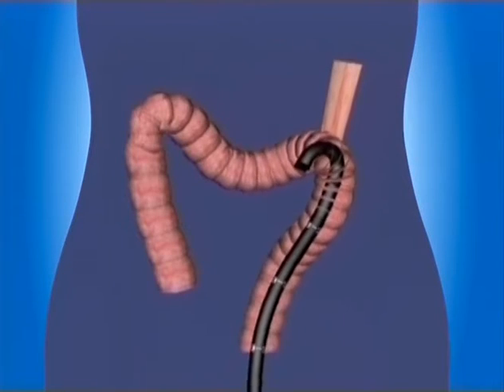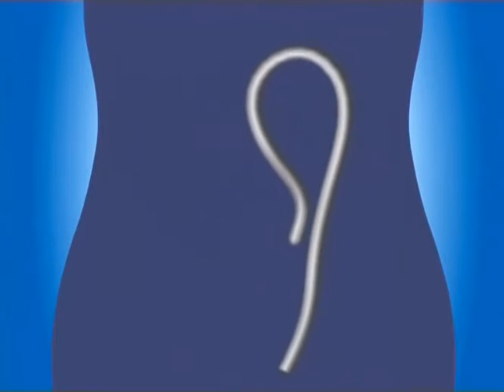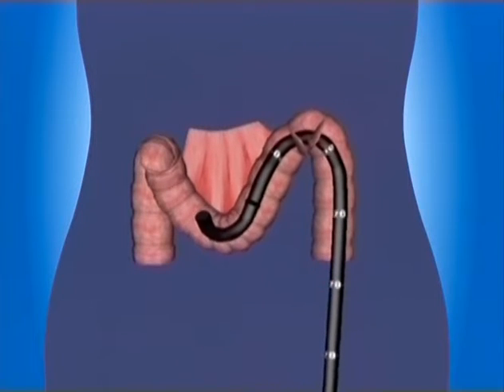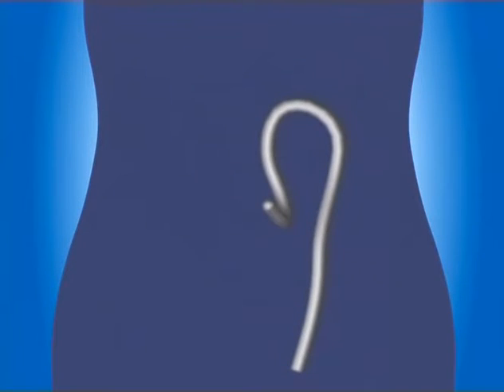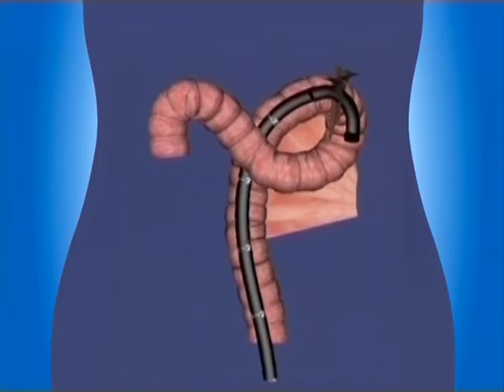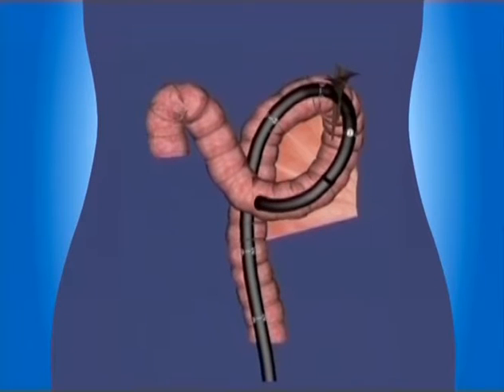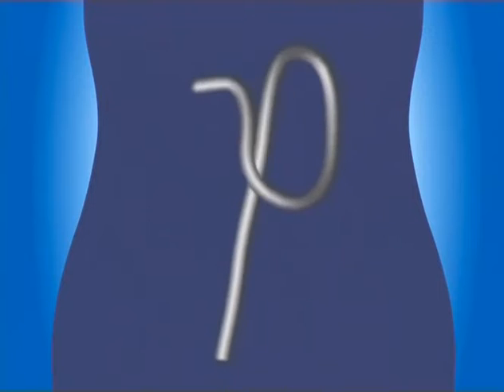splenic flexure is mobile on a lax phrenicocolic ligament. After further manoeuvring, later on, a deep transverse loop forms. The endoscopist would reasonably expect that pulling back would lift up the loop, but actually the splenic flexure pulls down again because of its mobility. Next, because of the total mobility of the descending colon, which can move into the midline, scope pressure pushes the colon into a reversed splenic flexure configuration. Watch it happen on the imager view.